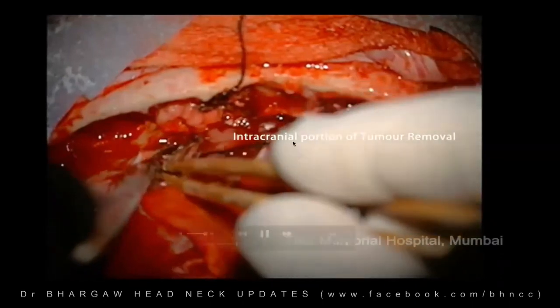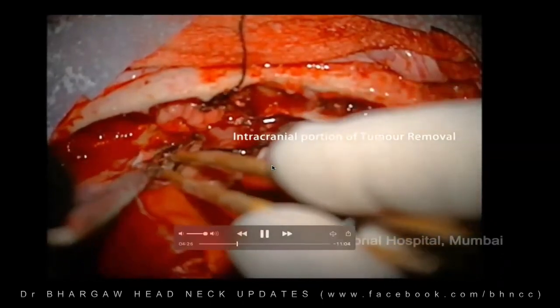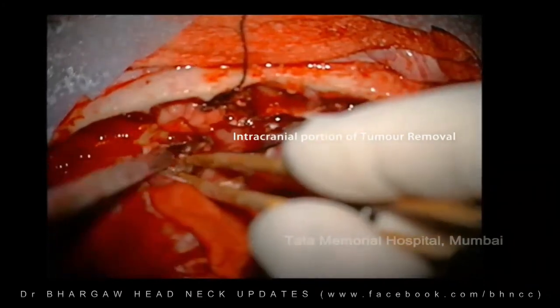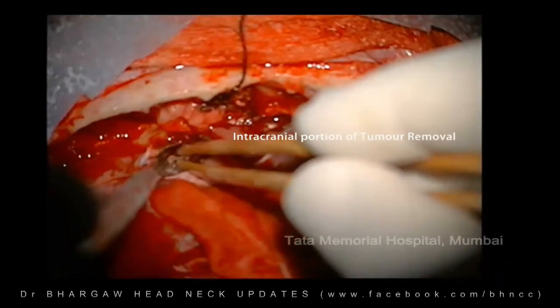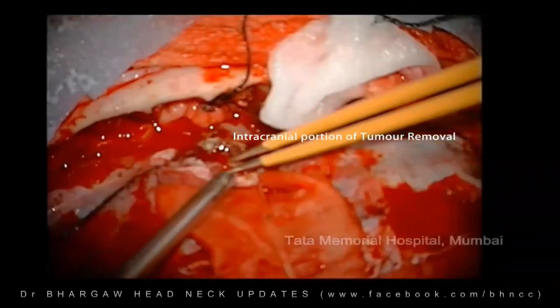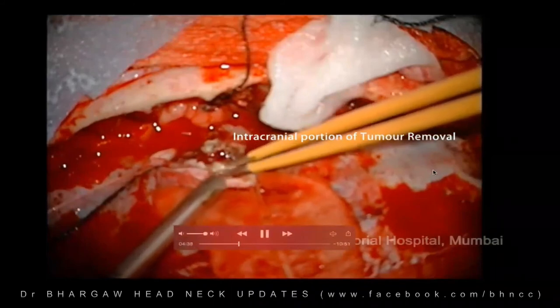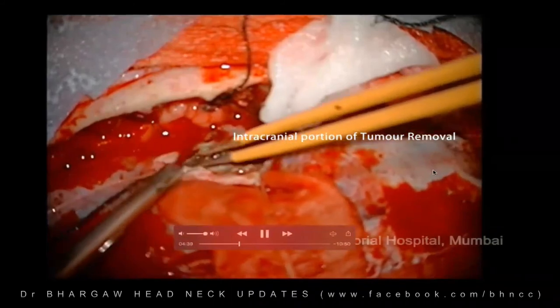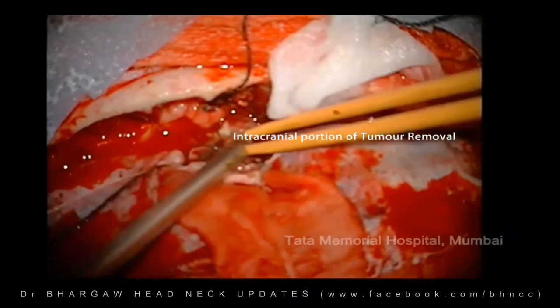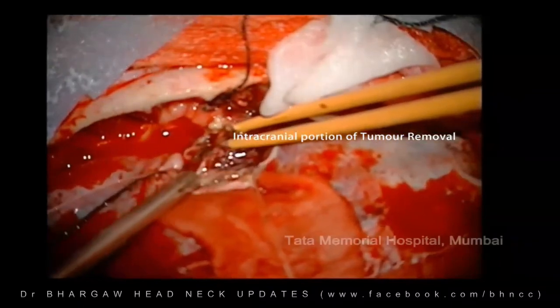So the intracranial portion of the tumor is being removed. It's just slowly being dissected away with some of the parenchyma that is there. You can see there's not much retraction being done on the frontal lobes. So that is very essential again to minimize the post-op complications.